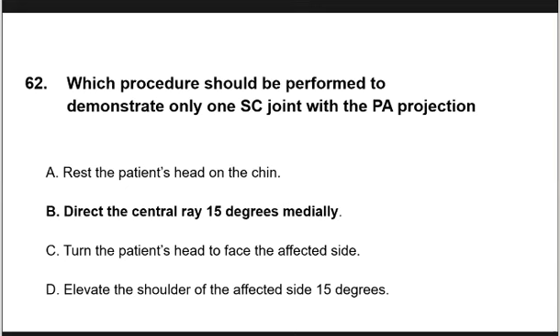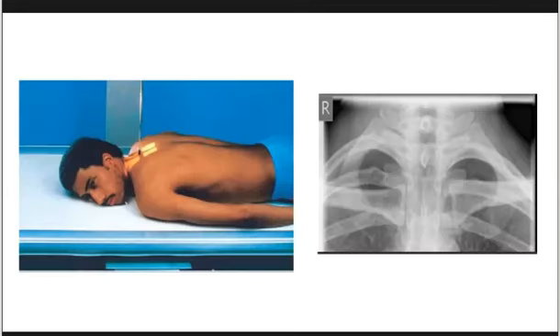Naka-angle ang tubo natin, like for example, this one. So kung yan ang titingnan natin, that is the PA projection, wherein we are going to demonstrate only one articulation or only one sternoclavicular joint.